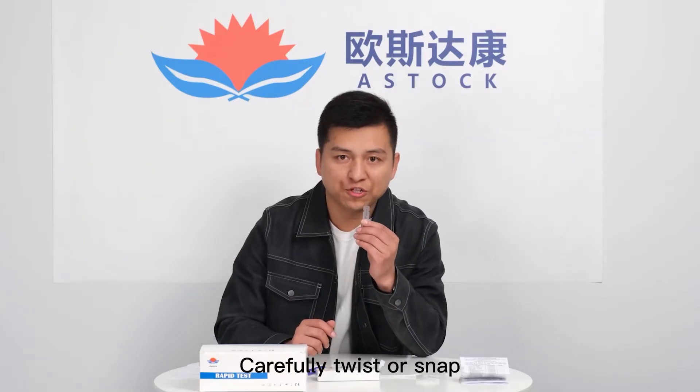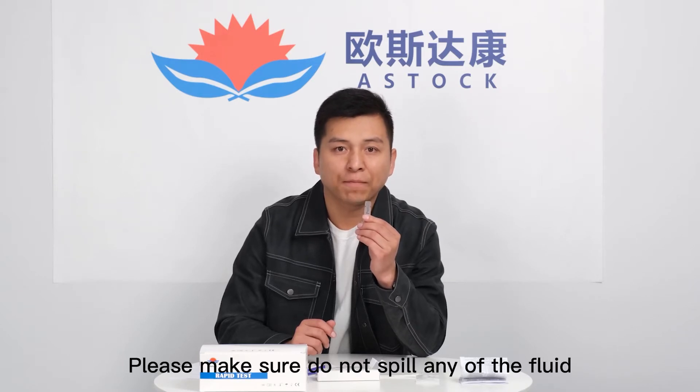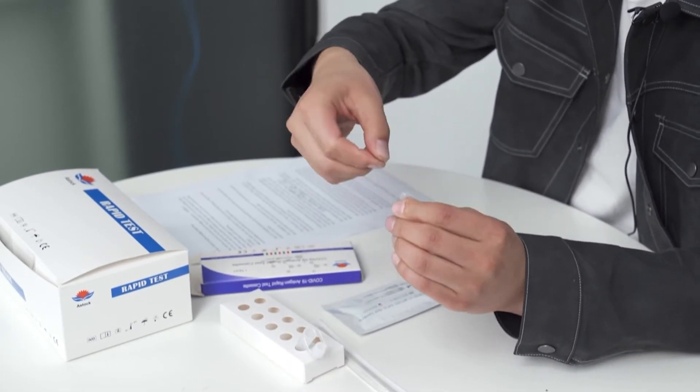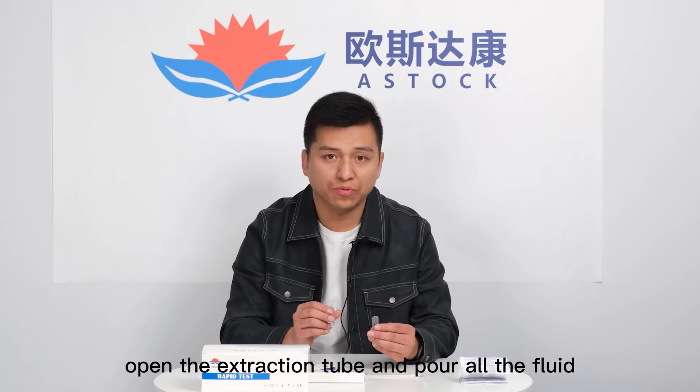Carefully twist or snap open the extraction buffer sachets. Please make sure you do not spill any of the fluid. Now open the extraction tube and pour all the fluid into the tube.